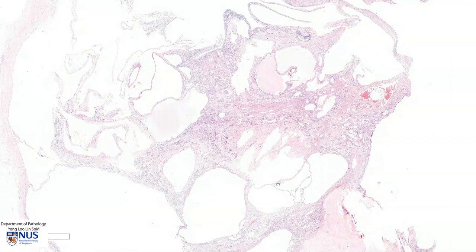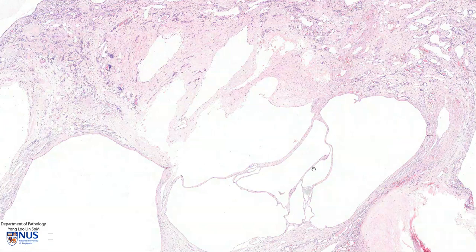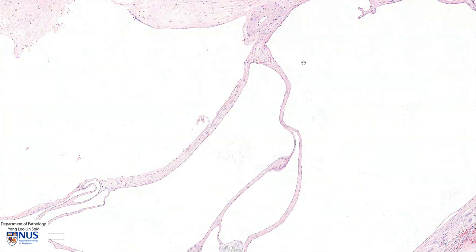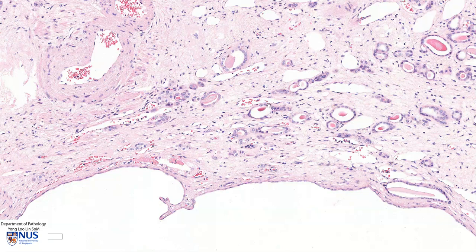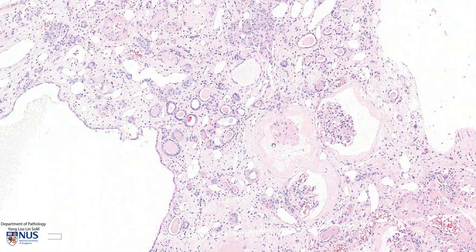In summary, this is an example of autosomal dominant polycystic kidney disease. We have numerous cystic structures that originally arose from the nephrons, and these cysts are lined by cuboidal to flattened epithelium. The intervening parenchyma shows tubular atrophy with interstitial fibrosis and mild chronic inflammation, as well as glomerulosclerosis. This condition can eventually lead to progressive renal dysfunction and renal failure.